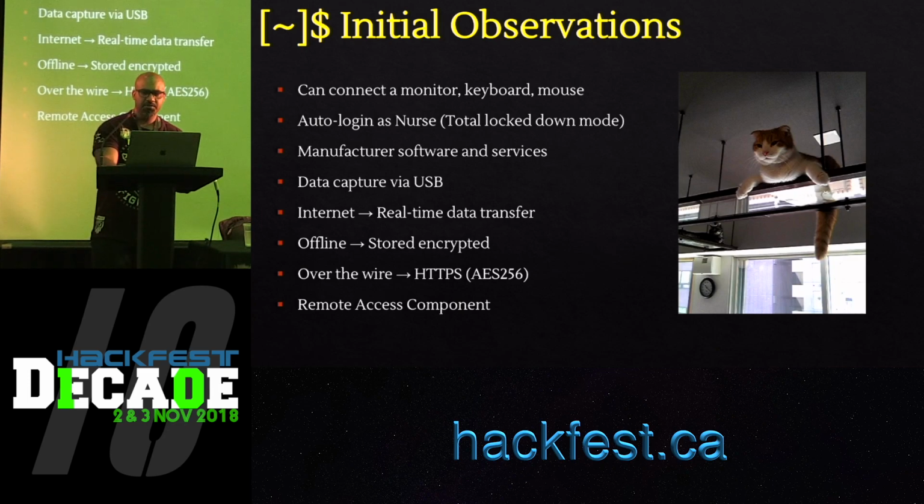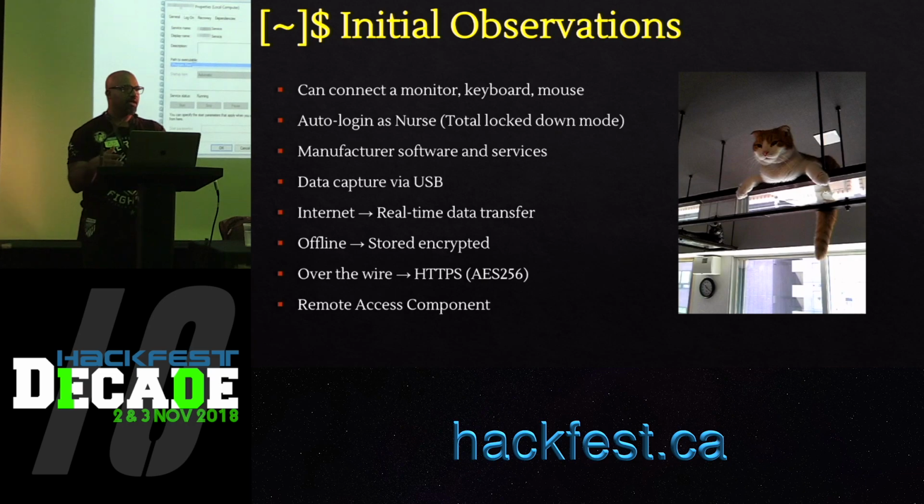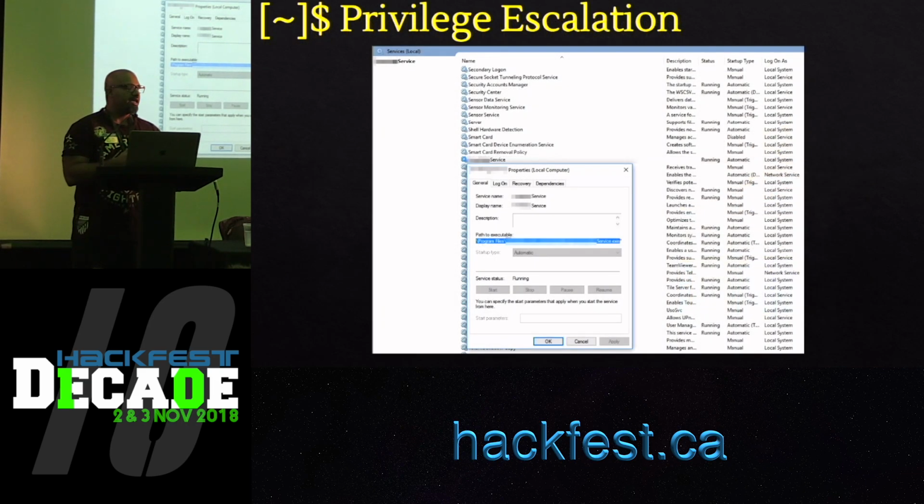So again, from a pen tester's perspective, we were able to log in as a nurse physician in a lockdown mode, but the goal was to escalate privileges to local administrator, so we could do much more. So we looked at different avenues. We tried different exploits that are out there for Windows 10, and they didn't work. We looked at different services. We couldn't find any service which you could start, stop, or modify properties for. But we found one service, and ironically, it is one of the manufacturer's applications, which didn't allow us to restart the service, but it allowed us to change the service binary on the operating system.